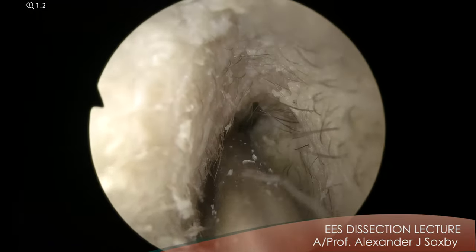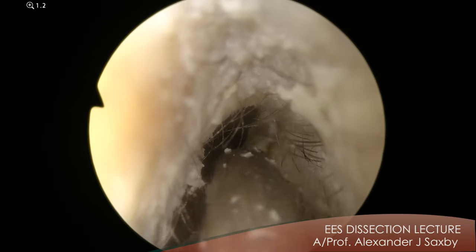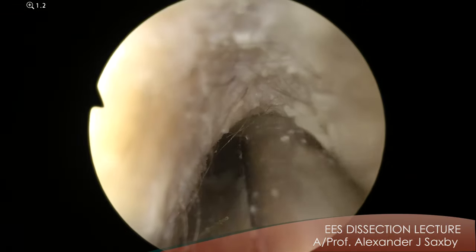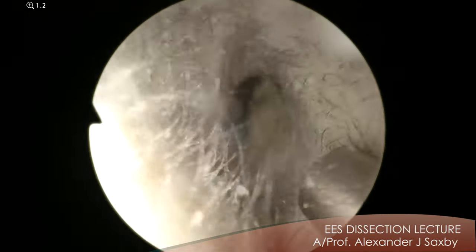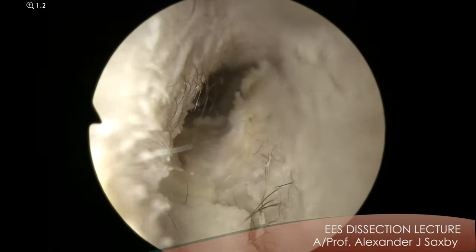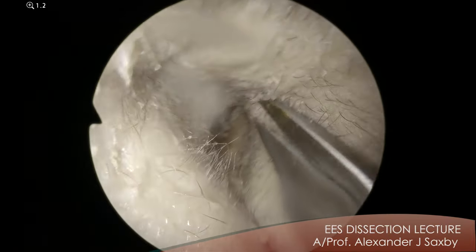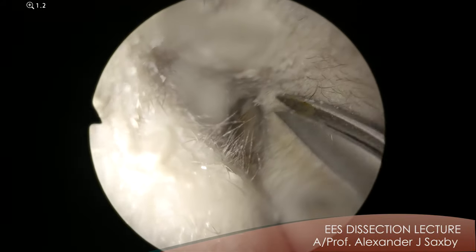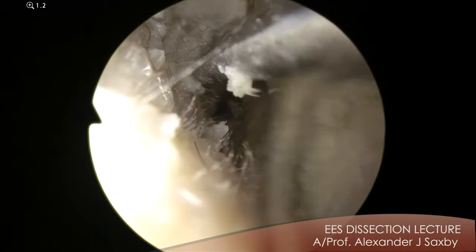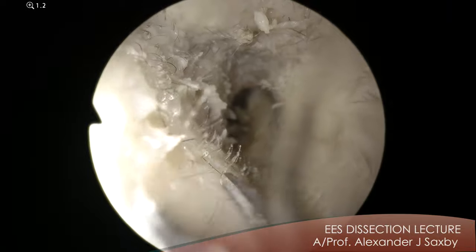In my experience, I prefer the subtlety of just holding it in your fingertips like a musical instrument. I think you get a more balanced positioning of the endoscope. For the zero, I like the cord between my fingers, fingertips on top, and then the thumb underneath. I advise you to try different techniques and find which is best for you. So that's most of the rubbish out. I prefer the iris scissor to the Beluchi to cut the hairs, but it doesn't really matter. It's a very, very important step. Time spent doing this will save you time later.